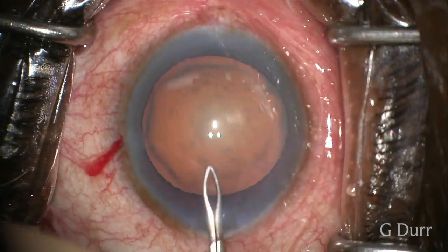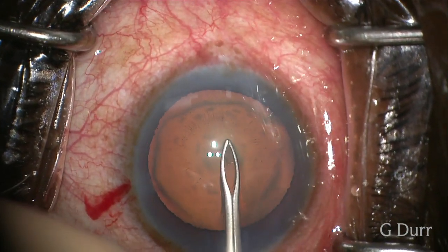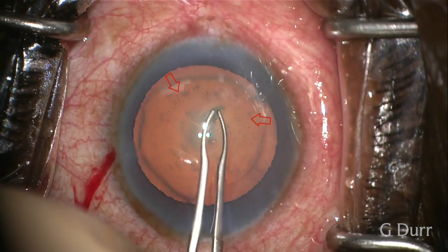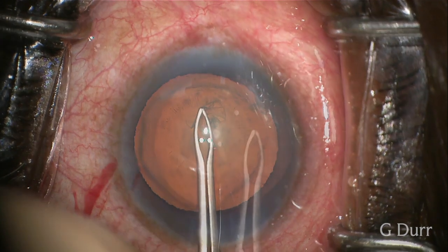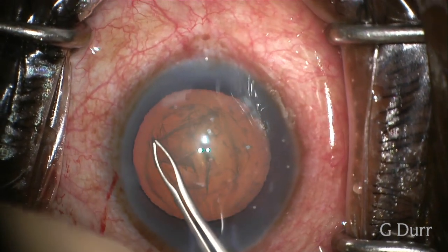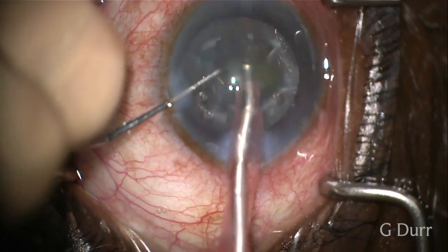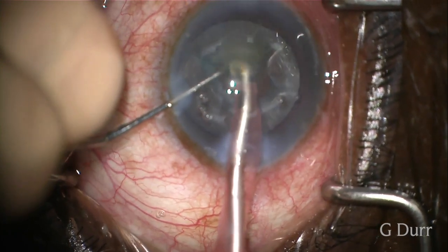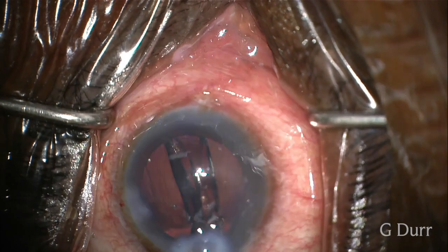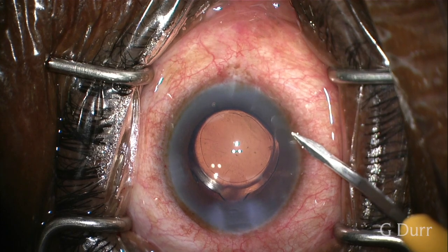So when we examined the patient, the angles were fairly open except for the area where the iridotomy was done, which was nasally. We had some focal PAS, and we were seeing a lot of pigment in the angle, and as we see here on the capsule as well. So there was a significant amount of pigment dispersed after the peripheral iridotomy, and the pressure wasn't reducing despite topical treatments. And so we decided to do the cataract surgery, as well as a goniotomy and a viscodilation.